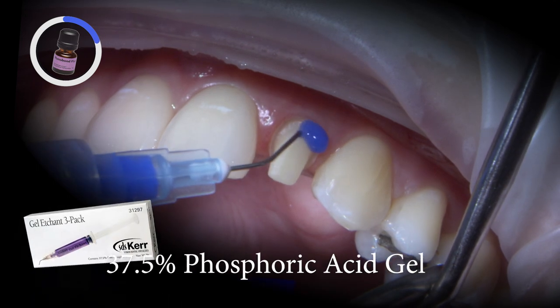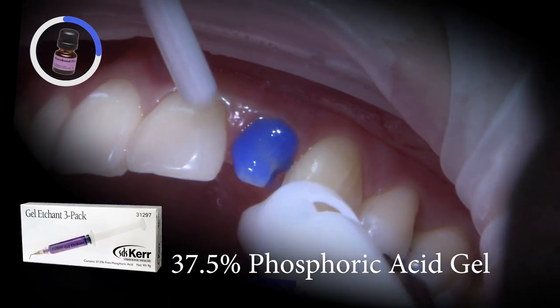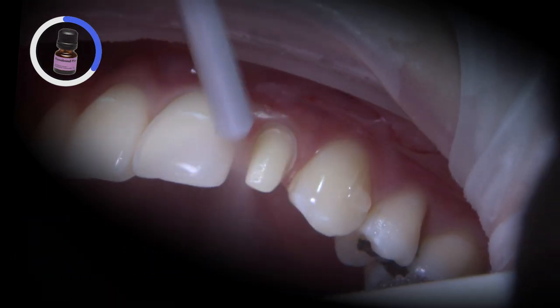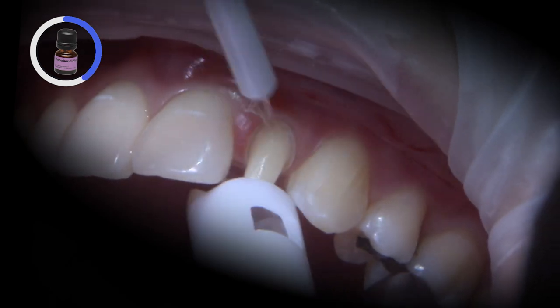Then I treated the tooth with a 37% phosphoric acid etch for approximately 10 seconds, followed by copious water rinse for 20 seconds and air dry, leaving the dentin moist. I avoid desiccating the tooth that might cause post-operative sensitivity.